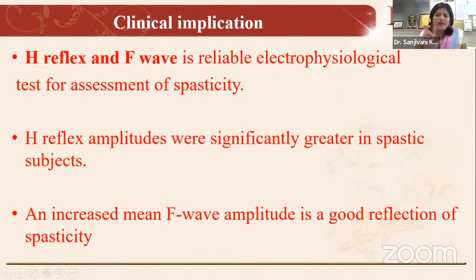The H reflex amplitude was significantly greater in spastic subjects. Again, this will be research related. So how will we get the amplitude of pre and post, and how do we compare? An increase in the mean amplitude will be a good reflection of spasticity. So again, it will be related to your amplitude.